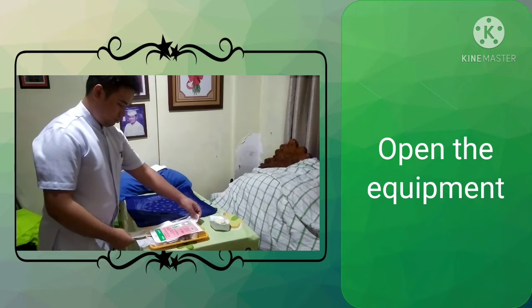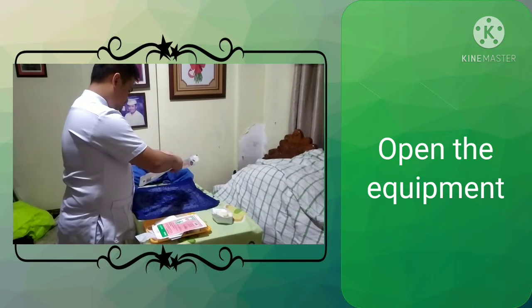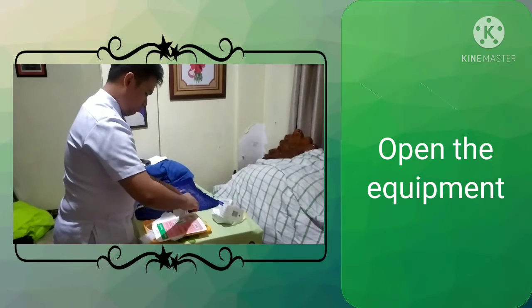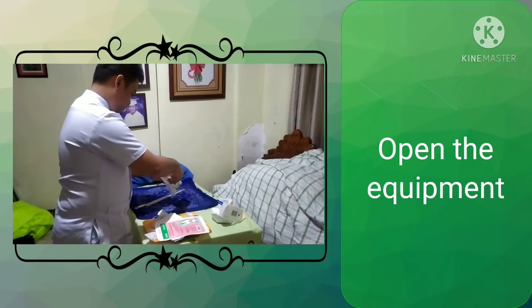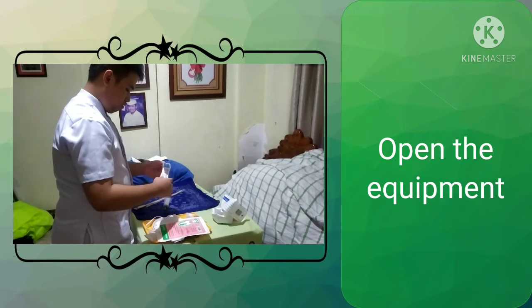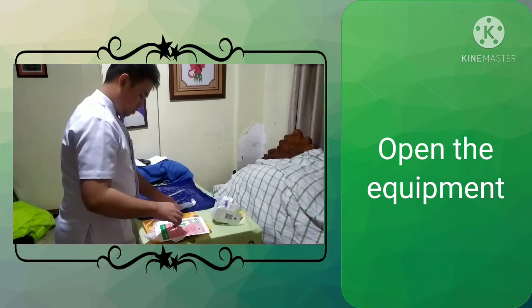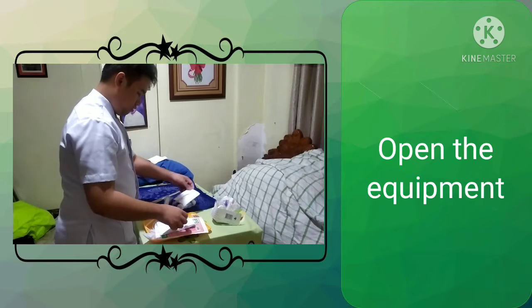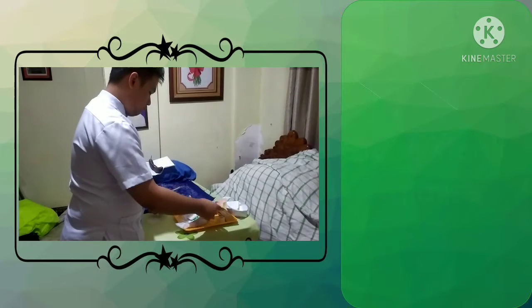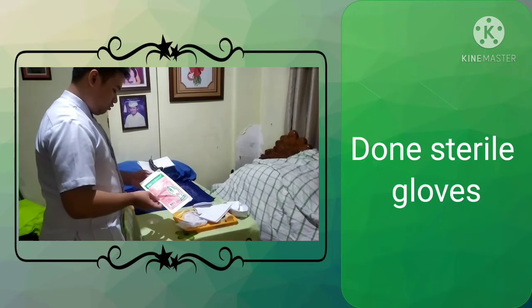Next is to open the equipment and set it up on the sterile field. Next is to don sterile gloves.